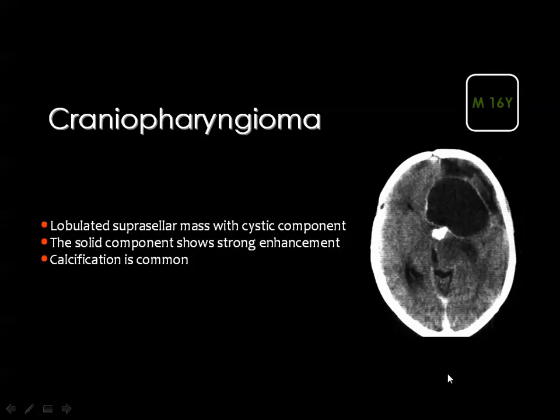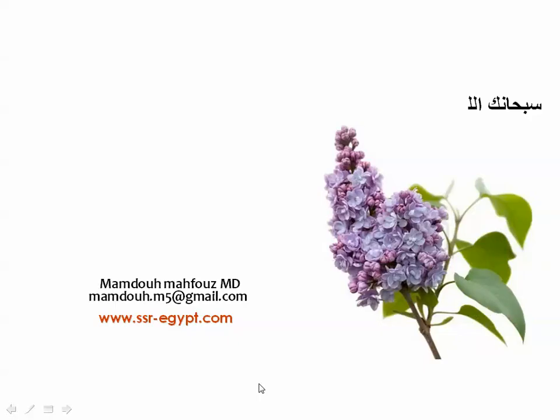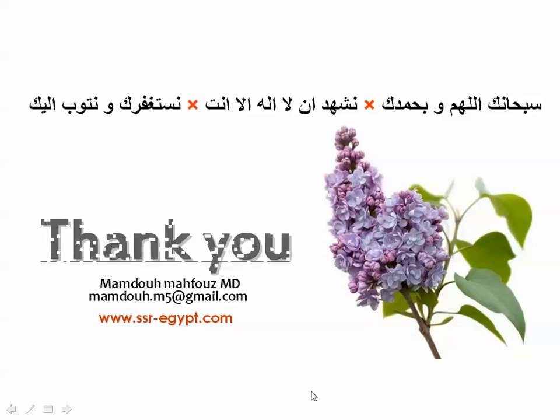Then one of the cystic lesions also intracranially is the craniopharyngioma, especially the adamantinomatous type, with characteristic cystic component, solid component, and calcification. And this will also be discussed in full detail in the lecture of the sella. And I thank you very much.